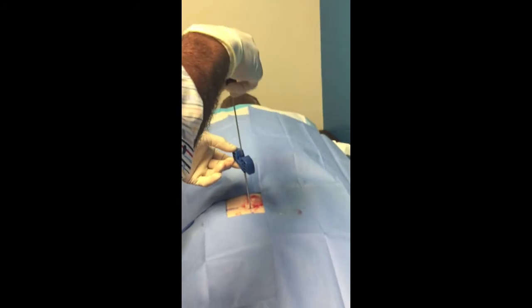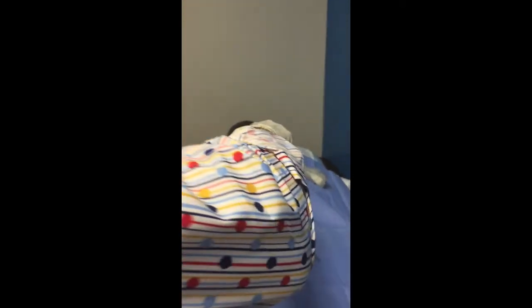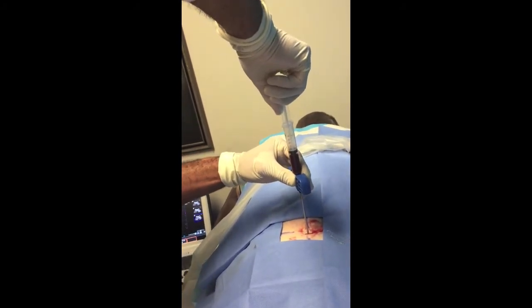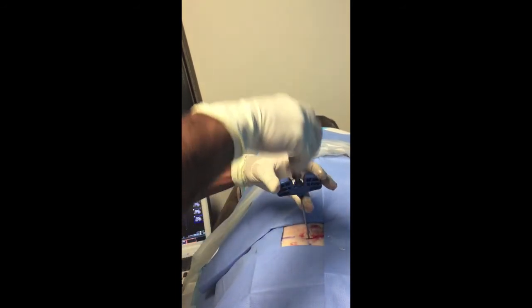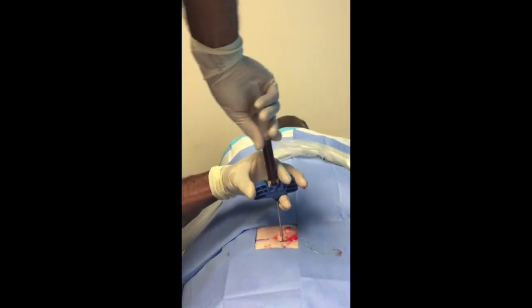Are you in? Yeah, we're in. Did you feel any pressure right there? I didn't. Usually when the stylet comes out, if we're in, that's when people feel the most pressure. I don't feel that, but I'm okay. Now you need to return. Yeah, with that bone, I bet you'd feel the pressure.